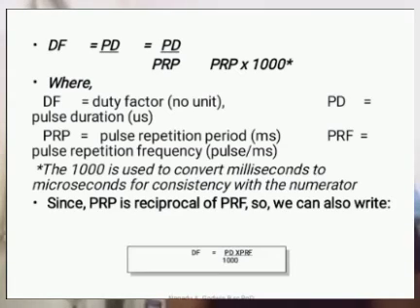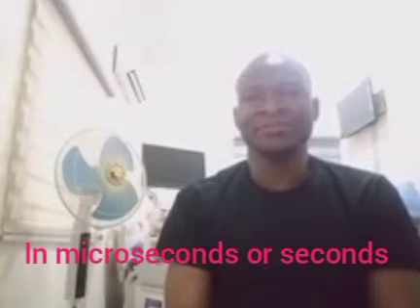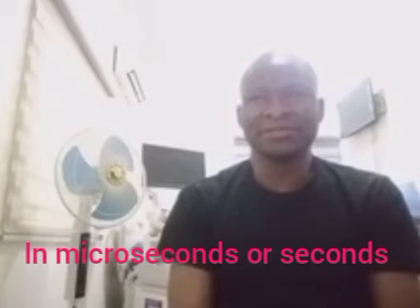In some machines you have the DF, where you adjust these things. So duty factor is pulse duration over PRP times 1000. The 1000 is used to convert milliseconds to microseconds for consistency with the numerator, because PD, pulse duration, is measured in microseconds.